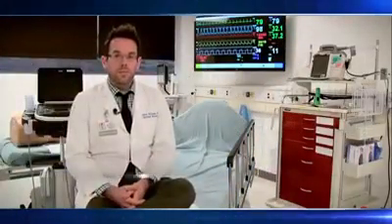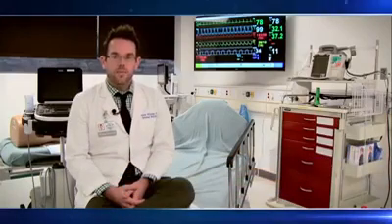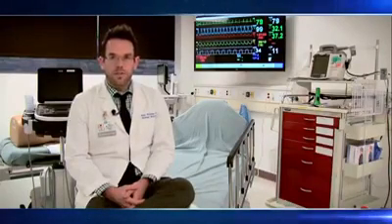Hello, I'm Jason Williams, a clinical instructor of hospital medicine and proceduralist at UCLA. Today we'll be covering arterial line catheterization of the radial and femoral arteries. We'll go over the indications and contraindications for the procedure, the equipment needed, step-by-step performance of the procedure, as well as potential complications to look out for.